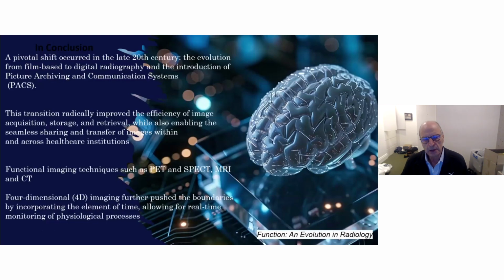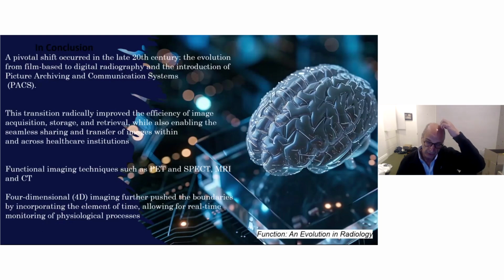I think it's very illustrative to look at the journey of radiology, why our specialty is so amenable to this. In the late 20th century, and I was part of this revolution, we went from film to PACS, so suddenly we had a digital archive solution, not only to make us much more efficient and give the ability to manipulate images, but it also gave us the ability to share images and health data.